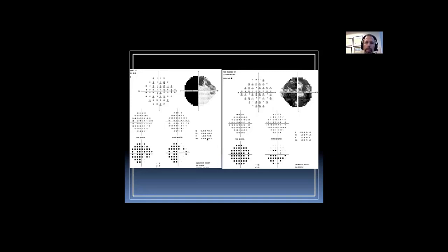What is your minimum visual acuity to perform a Humphrey visual field test? My minimum visual acuity depends a lot on the patient. Let's say the person is counting fingers, but they're counting fingers briskly in all 4 quadrants. You could consider a size 5 test object. Hand motion, I'm probably not going to even try automated perimetry if their vision is hand motion or worse.